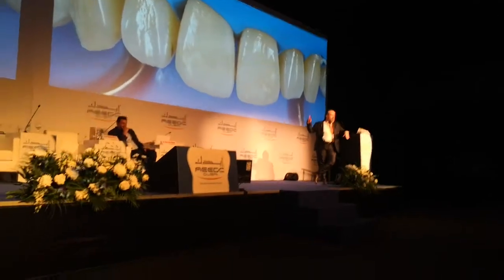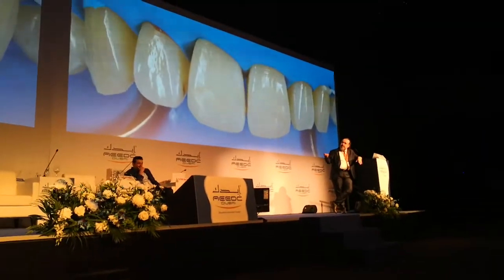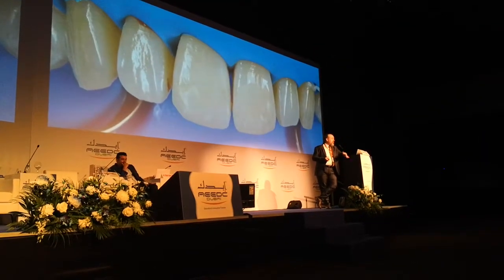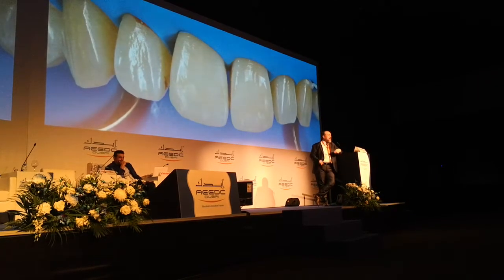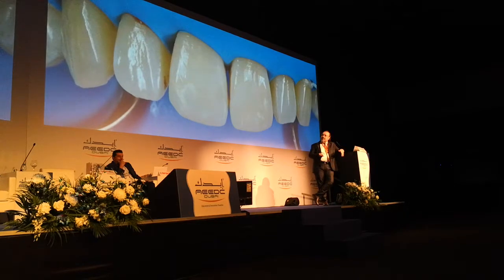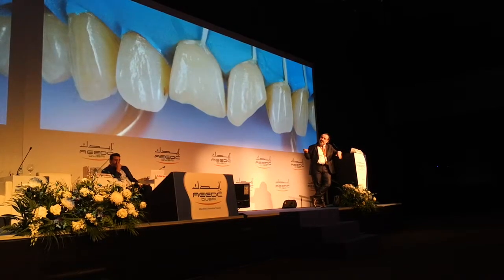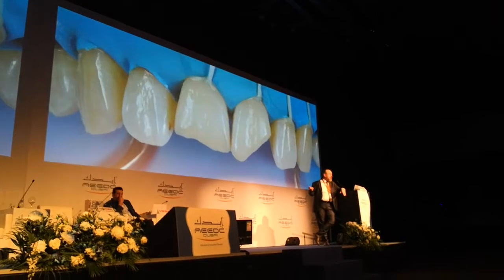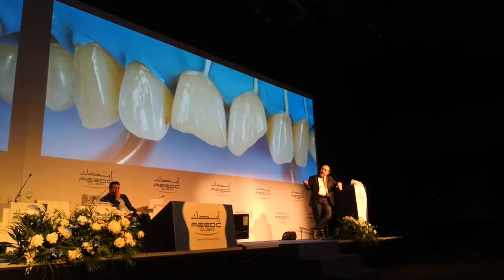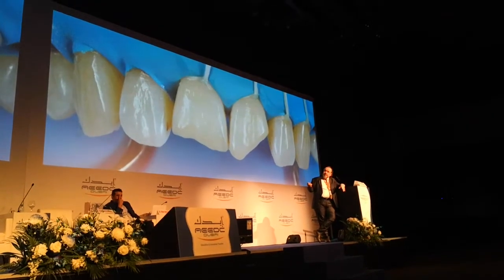And you get the silicone index portion. Here in this case I don't have the silicone index photos, but you see that mock-ups were there immediately because patients say okay, I just use the rubber dam and start the treatment and then I remove the mock-up. As you see here, very minimal prep on the buccal side, but there was a fracture here I need to remove that part. But the prep on the buccal side is not so large — I don't make a large prep till the cervical area.